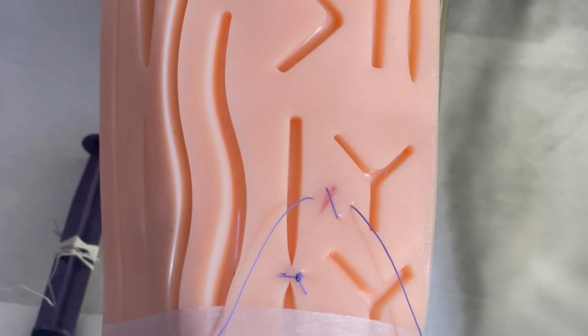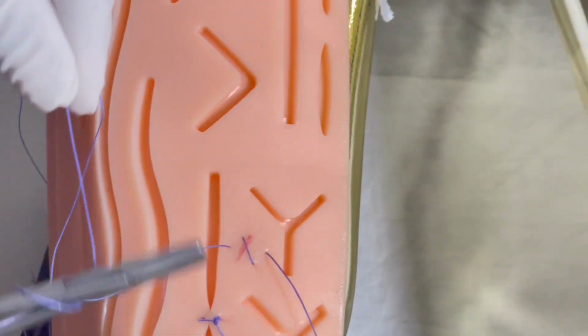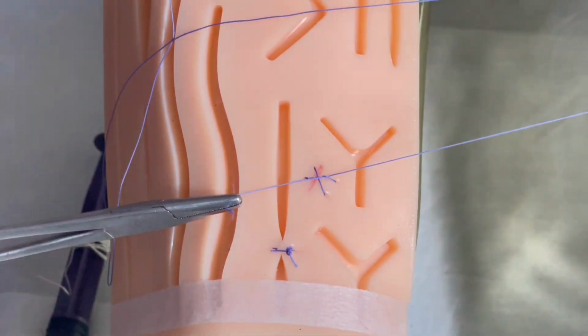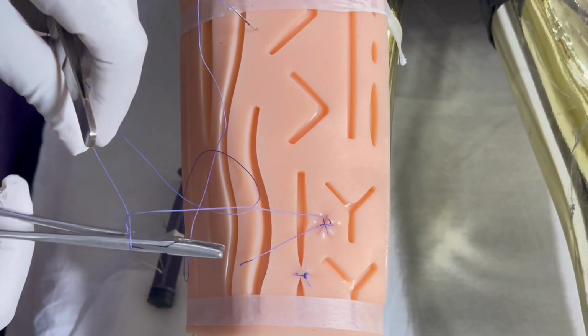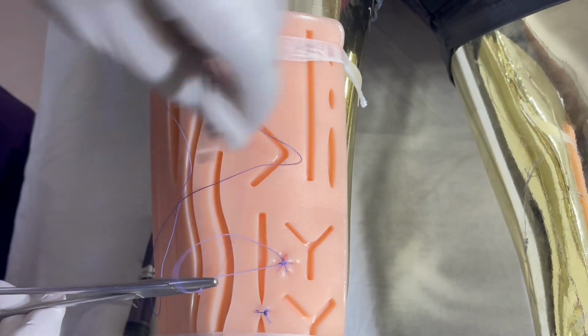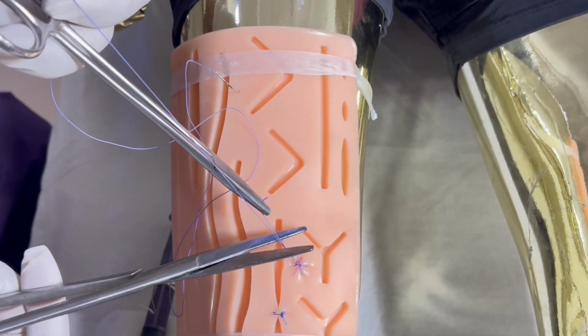Fix this needle, secure it on the pad, hold this, and the suture is like an X form, also called a figure of 8. In this manner the bleeder has to be stopped. So this is another way of suturing.